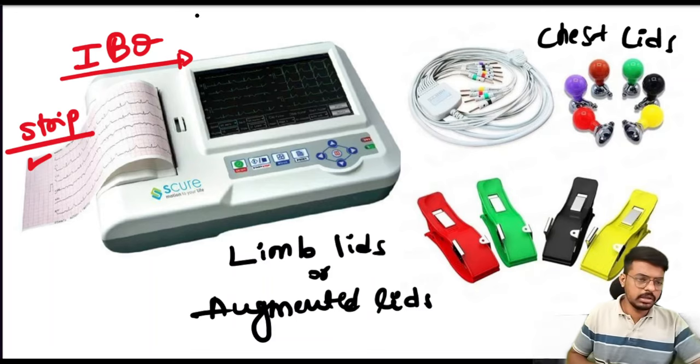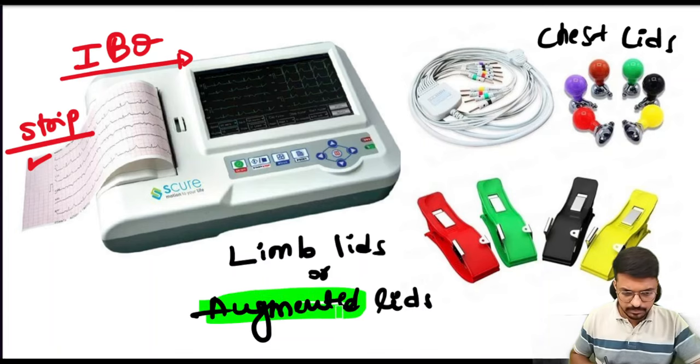Very important. These leads are used to apply to the limbs, all four limbs: to the upper limbs and to the lower limbs, four leads are there.